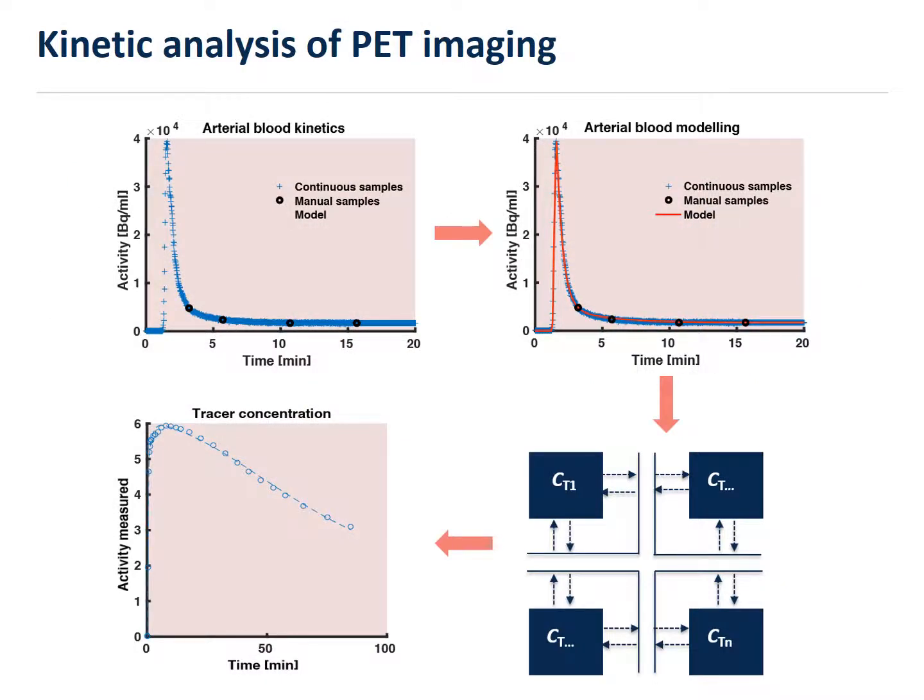In bolus injection PET experiments, blood samples are typically acquired manually and automatically. The automated blood sampling lasts approximately 15 minutes after the tracer injection, and it is performed by using a continuous blood sampling device, where blood is pumped at a constant rate through a well-shielded radiation detector. These blood measures need to be fitted with multi-exponential models to generate a time-continuous, noise-free curve that is used as the blood-to-tissue delivery function, also called parent plasma input function, of the tissue compartmental model that drives the data quantification.